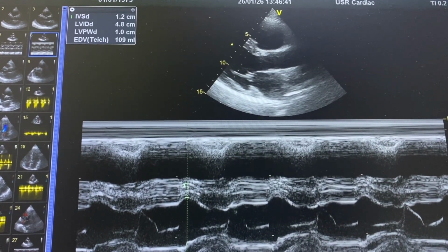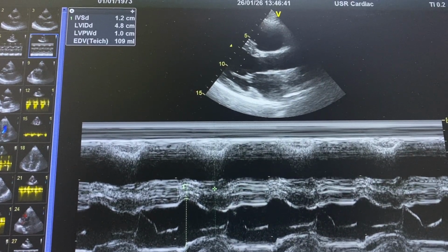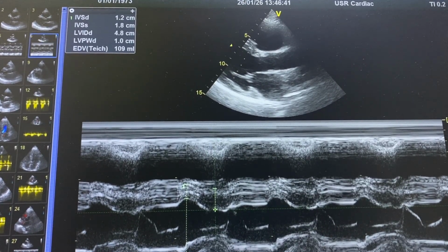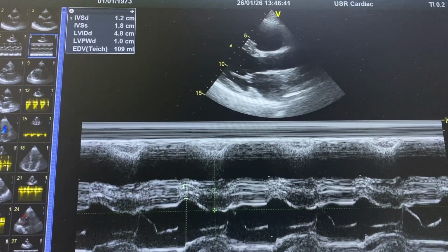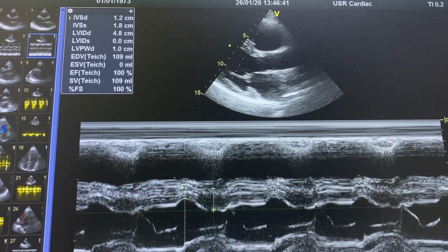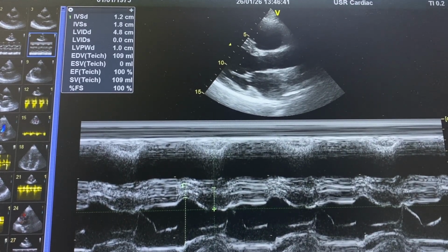And now next we are going to measure in systole. Again, you have to locate this one. We already said it. We are going to measure IVS in systole. We see the shortening. It has written posterior. S is going to come.